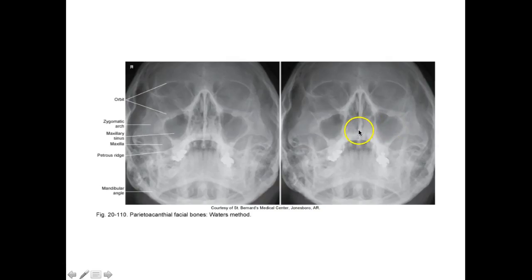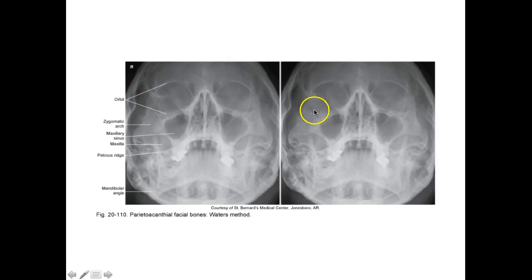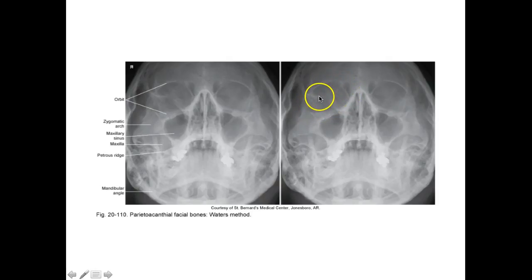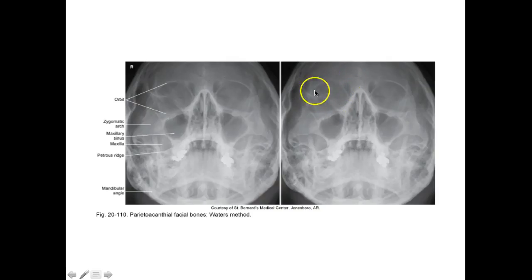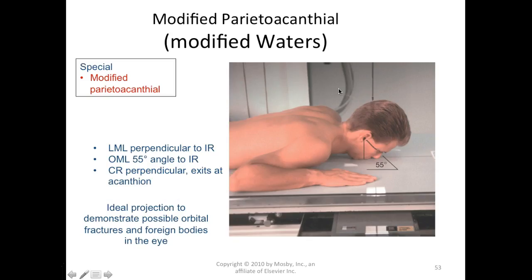Labeling on Waters: orbit, zygomatic arch, maxillary sinus, maxilla, petrous ridge below, vomer, perpendicular plate. You can see the zygomatic arch and maxillary sinus clearly. Note that the orbit looks a little distorted from the steep angle — we're going to talk about the modified Waters next, and I want you to remember what this orbit looks like.